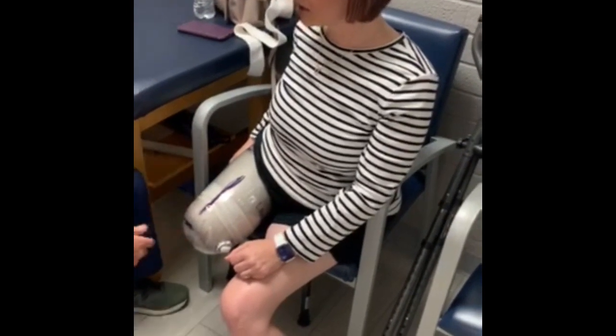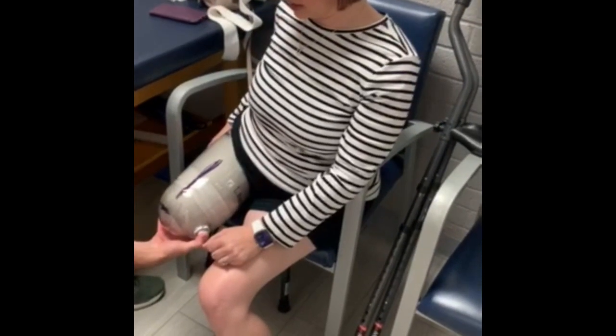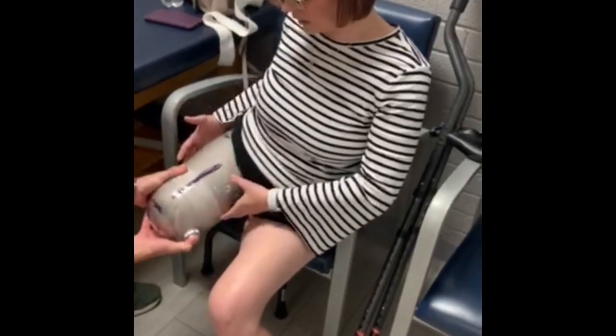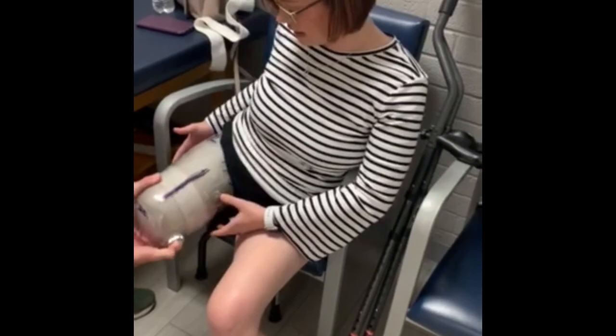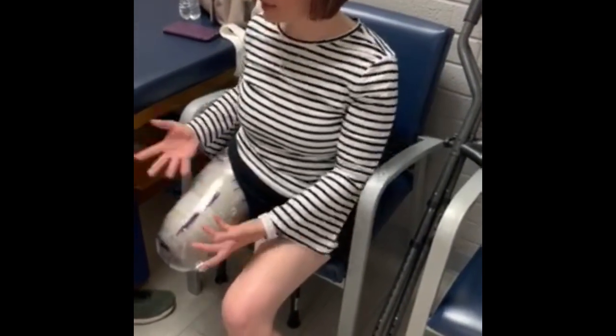What some people sometimes do, because you feel all that up there, you feel the hard seat, is just press. Did you hear it? And you probably saw a little bit. Felt it a little bit, yeah. And just ease it down a little bit. Just get a little bit out of it, so that it's not all up in your butt. So now I can sit.